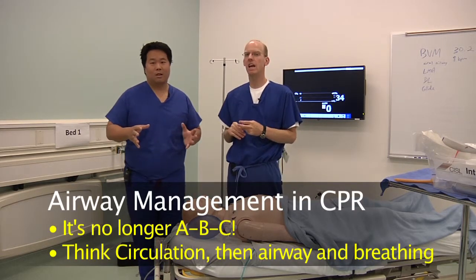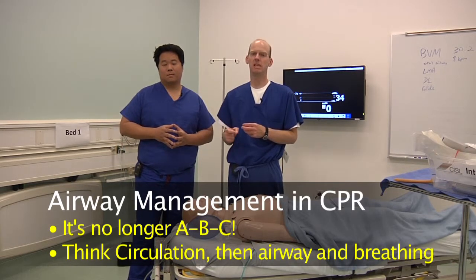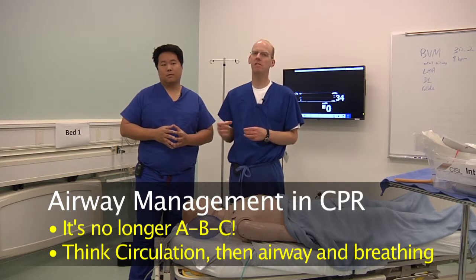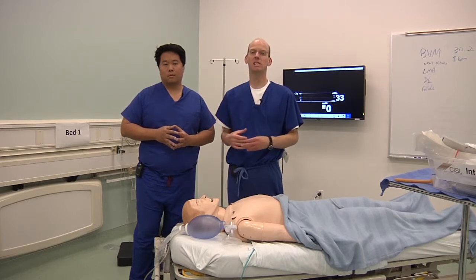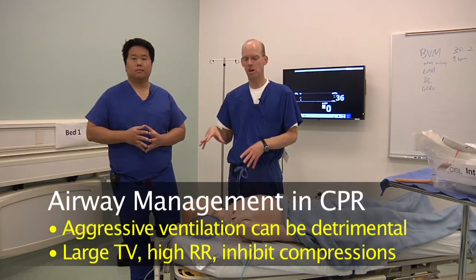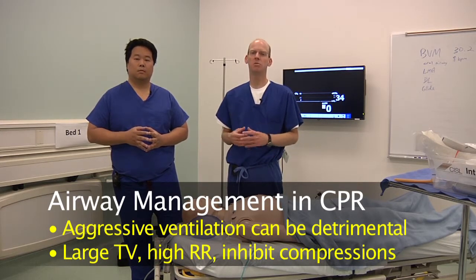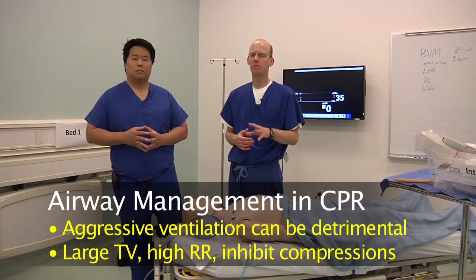It has changed. And you're often able to get at least marginal ventilation, which is all you really need, is to get a little oxygen in. You're not going to try and really ventilate these patients aggressively. We already went over that. Aggressive ventilation is actually detrimental. Large tidal volumes, long inspiratory holds, high respiratory rates, all cause negative performance with your compression. So less is more. Do what you can.